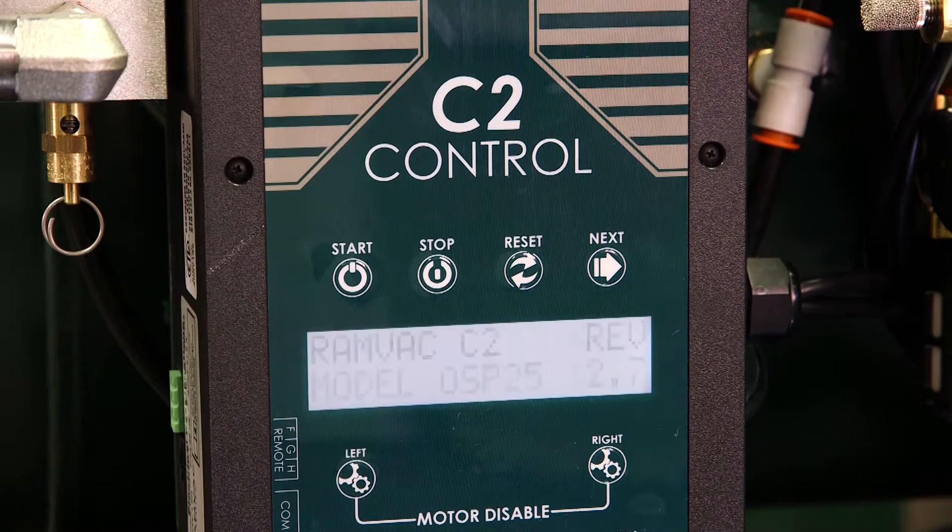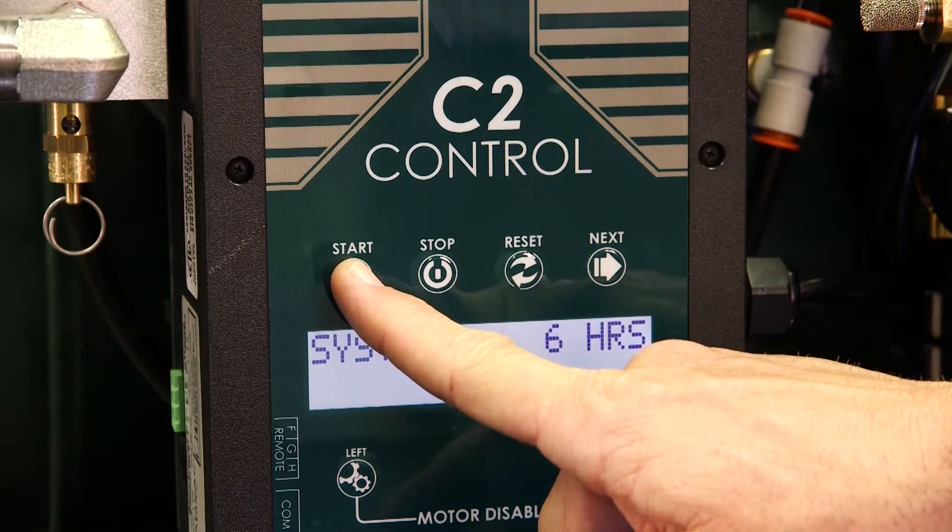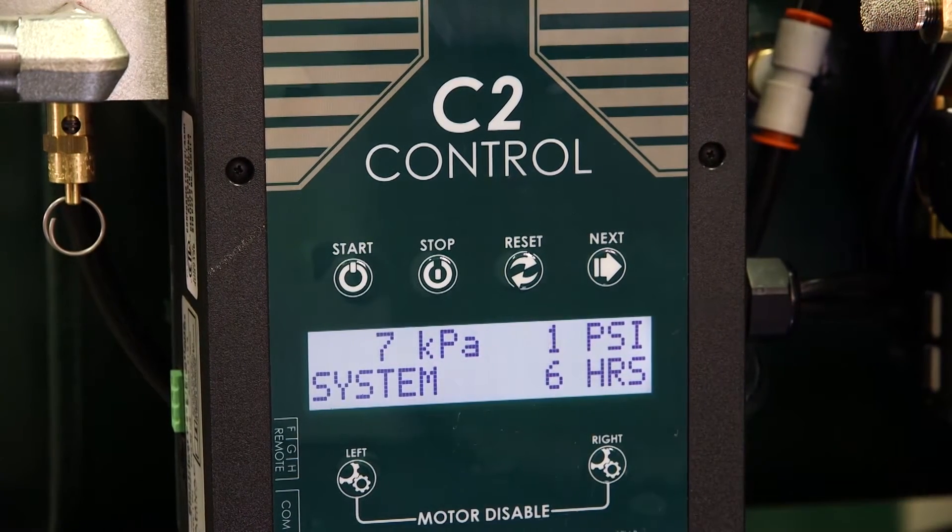Next, plug in the compressor to return power. The last step is to return the compressor to service by pressing the start button.